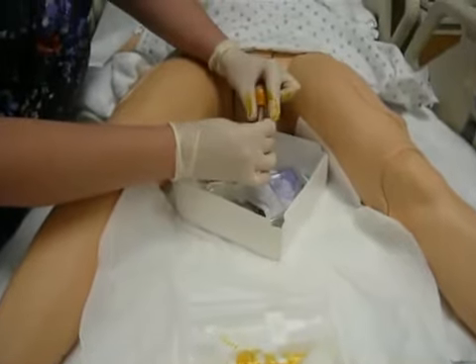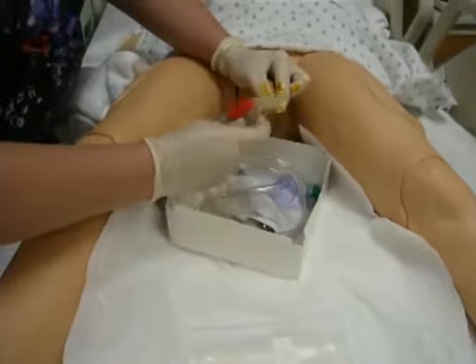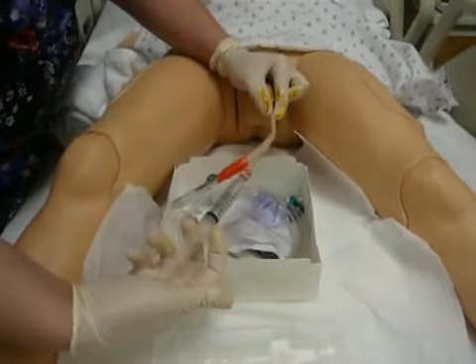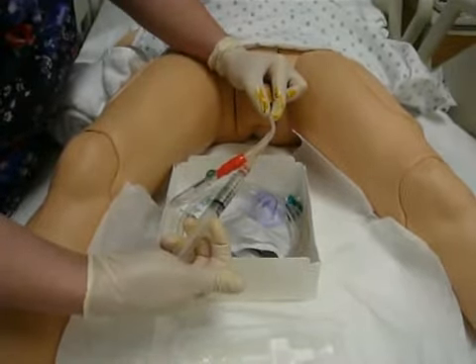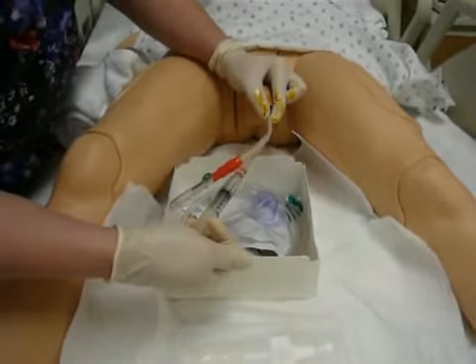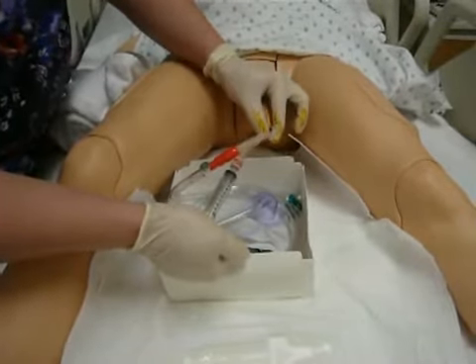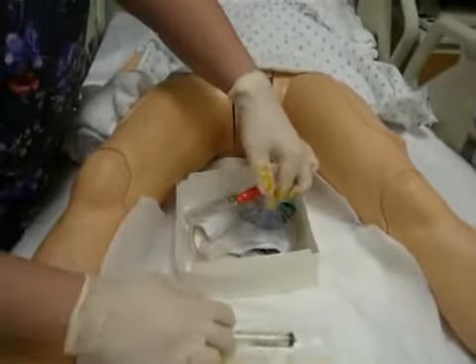I'm going to bring my thumb and first finger off, like that, to make sure that I have a little bit of room in case I need to reposition the catheter. I'm going to grab my syringe with sterile water and begin to inflate. If I meet any resistance or my patient complains of any pain, I stop, look at what I'm doing, and reposition. He does not complain of any pain. I'm going to continue to insert the water. I fill the balloon up with the 10 cc's of sterile water. Once that's done, I can bring my fingers off, disconnect here, and put that down.